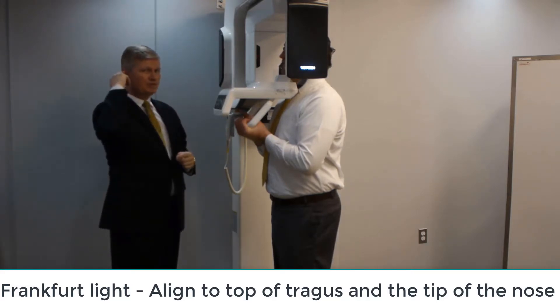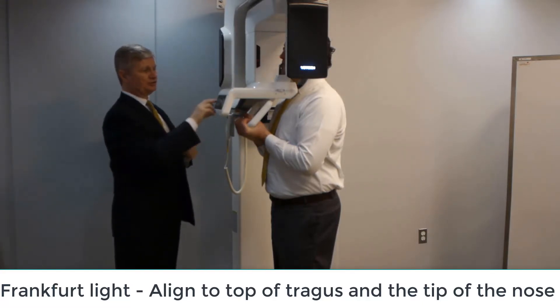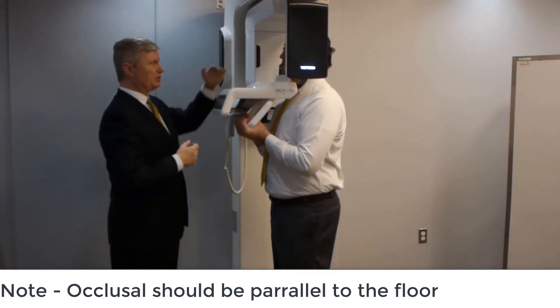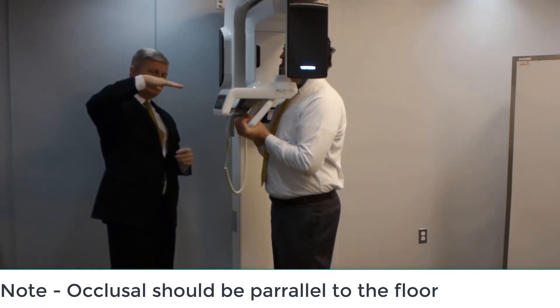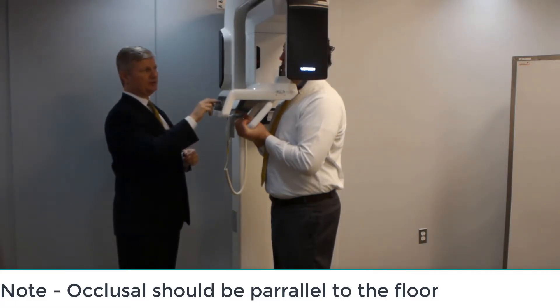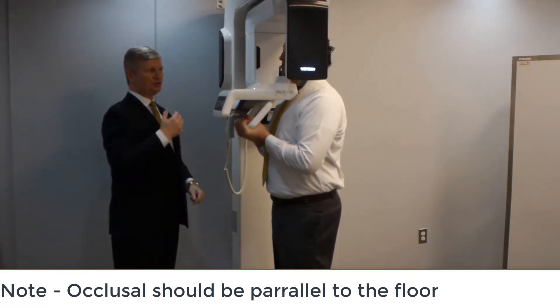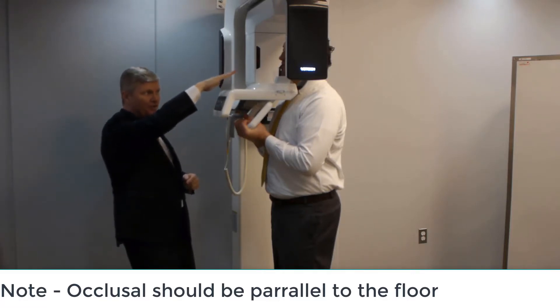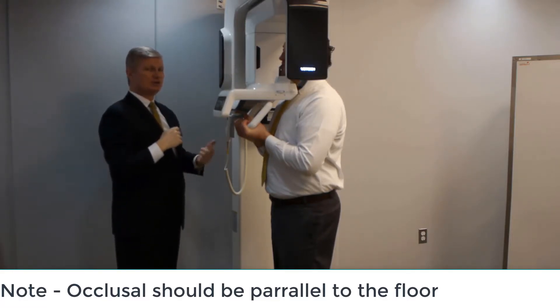To align the occlusal plane, we use the Frankfurt light going from the top of the tragus to the orbital rim. I'll bring the Frankfurt light down — now it's at the top of the tragus and at the tip of the nose. To verify the occlusal plane is parallel to the floor, I'll have the patient smile, and I want to make sure it's level going from side to side and front to back. The patient's occlusal is tilted back slightly, meaning the head is tilted up too high, so I'm going to bring the machine down a little. It's important that your eyes are at the same height as the bite stick to see whether the cusps of the teeth are parallel to the floor, both side to side and front to back.